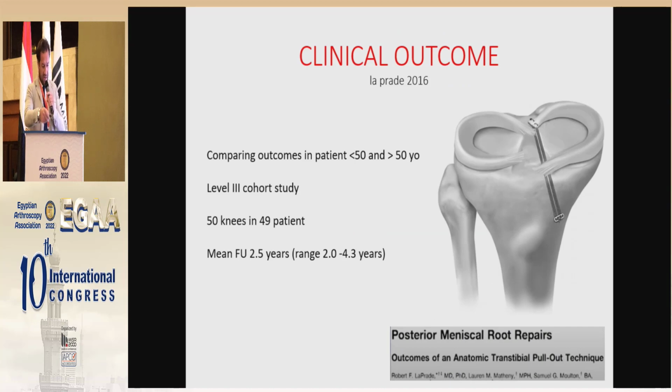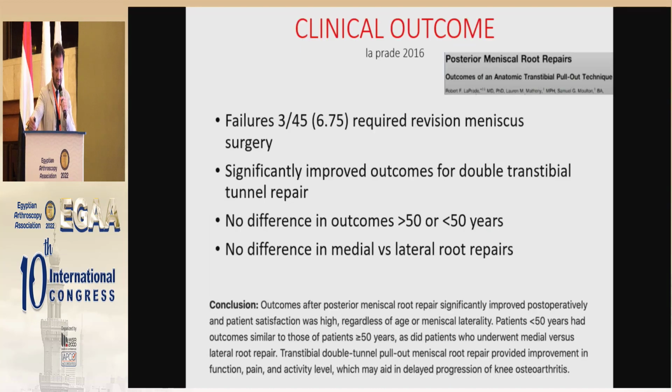Another clinical outcome is from the work of LaPrade, and he showed that in his work there were 3 failures in 45 knees, so only 6.75% required revision meniscal surgery. There is a significantly improved outcome for his technique with double transtibial tunnel repair for better control and better integration in the bone. No difference in outcome over and under 50 years old, and in medial and lateral root repairs.